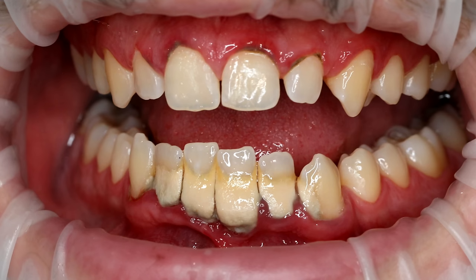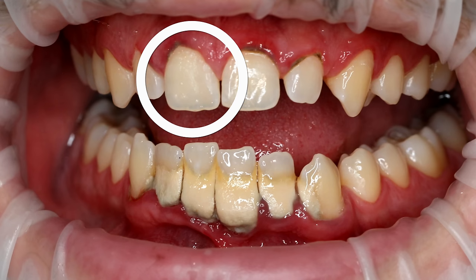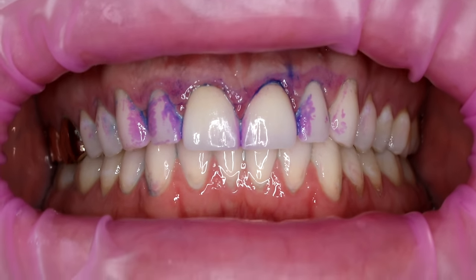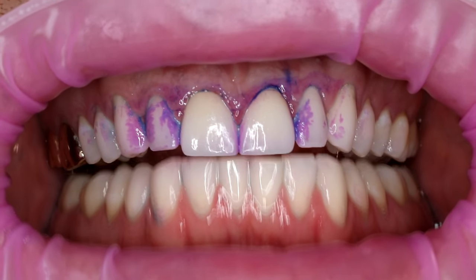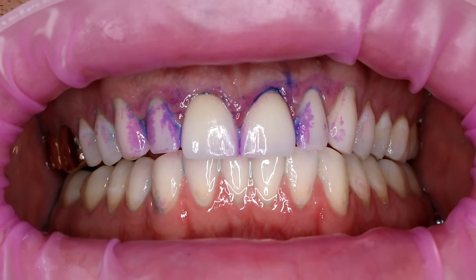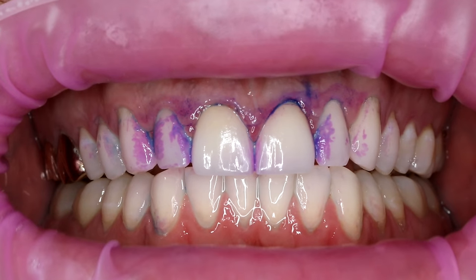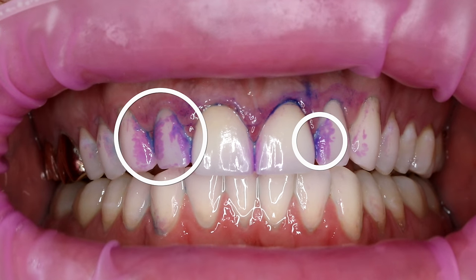Take a look at this picture from before applying. You can clearly see on this tooth that there's a spot being missed at home, but he's had no idea. So here's showing my teeth. As a dentist, you would think I do a pretty good job cleaning my teeth, but clearly this agent's showing otherwise. I need to do a better job here, here, and here.